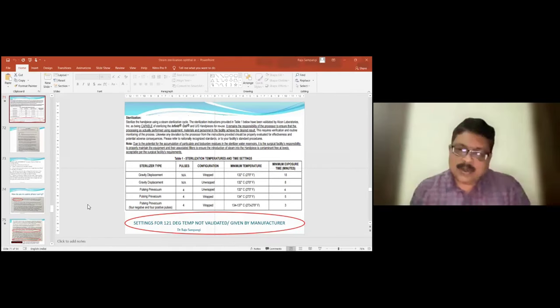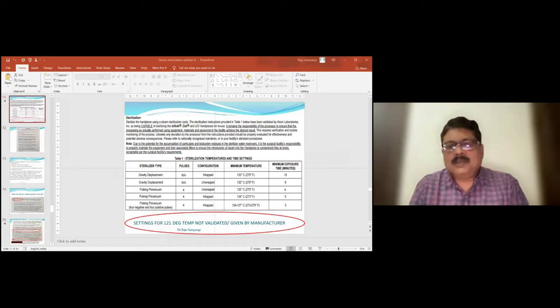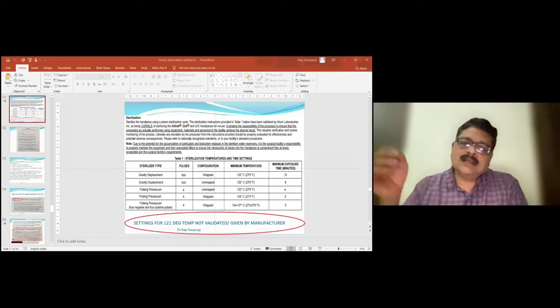Actually, when we add something, yes, sir. Even the hospitals that are not going for NABH or anything like that, even apart from all those things, I would say monitoring sterilization is important for 2-3 reasons. First thing, as Dr. Raju has pointed out, it's a probability. It's a blind process. You can never have a real-time test to find out whether the instruments were sterilized as soon as you remove them from the autoclave. There's no test in the world to do that. That is the first issue.